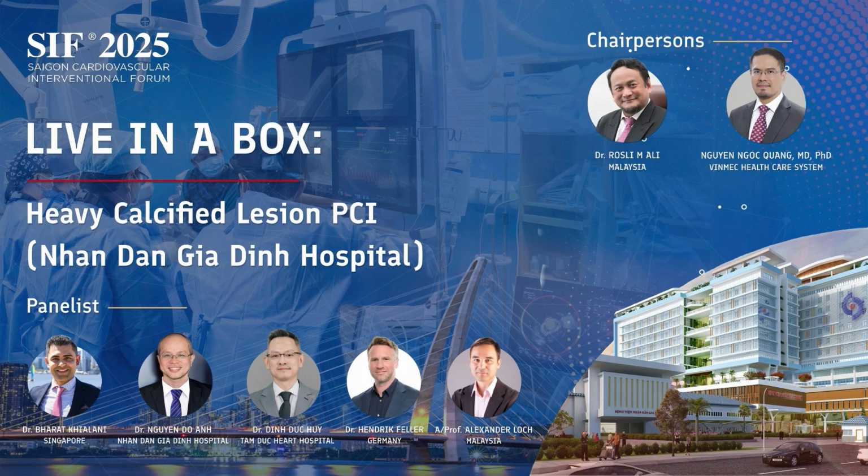But it depends on which devices I have in the cath lab. Either a cutting balloon or a scoring balloon will work, because now we have more flexible balloons. Otherwise, I think IVL can be a good choice for these situations. Then we balloon with IVL from the whole LAD to the left main, and image again after that before stenting.